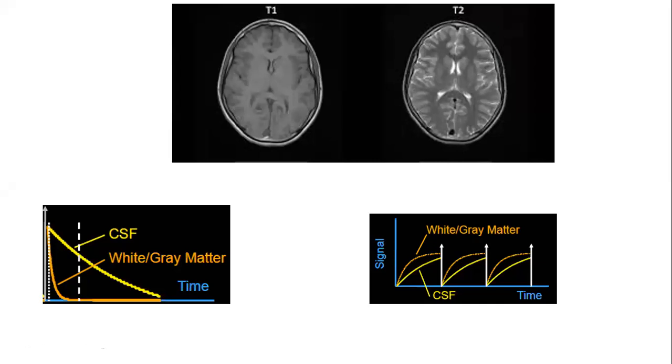If we wait for a very short while before we take our image, a short TR, we are going to have this. These are TR times.